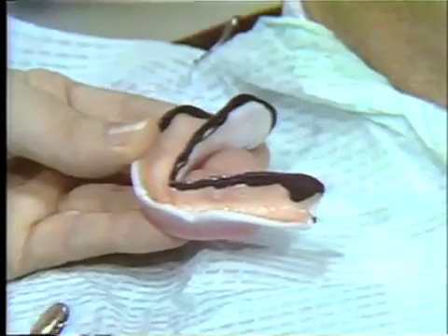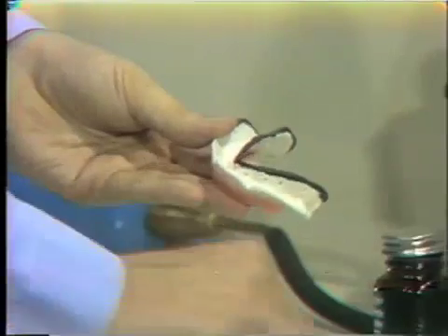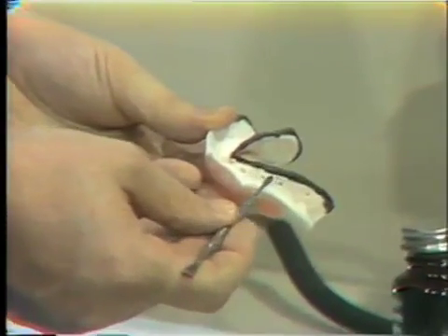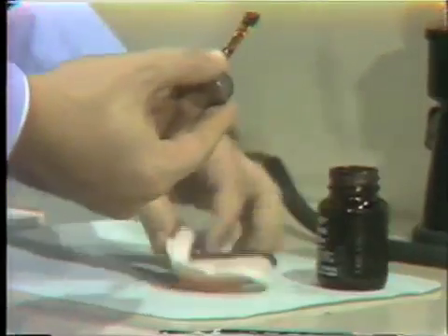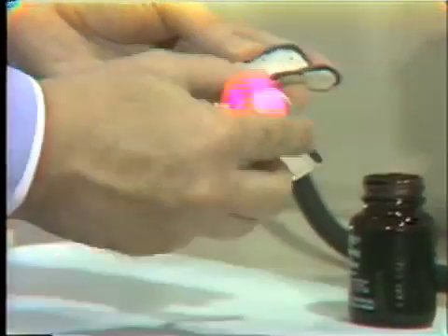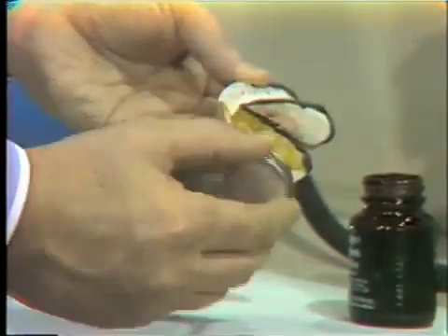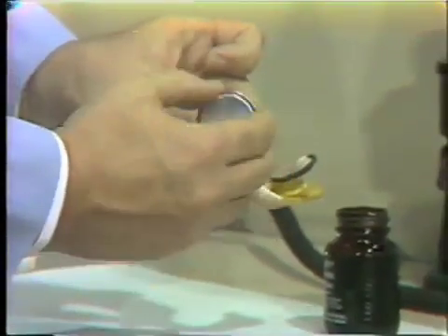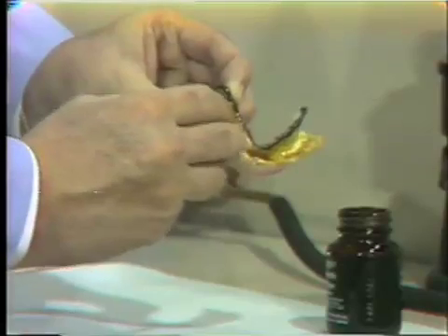At this time we will remove the pink wax and gently round off the compound in preparation for the final impression. We have removed the spacer now and rounded off the border-molded compound. We will take the adhesive for our light-bodied rubber base and paint the adhesive on the tray — a very thin application through all parts of the tray, especially out onto the periphery, covering all parts of the tray adequately with the adhesive.